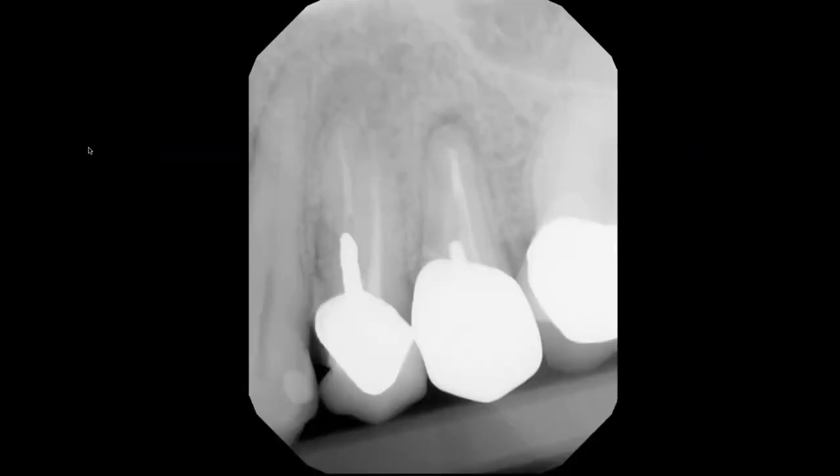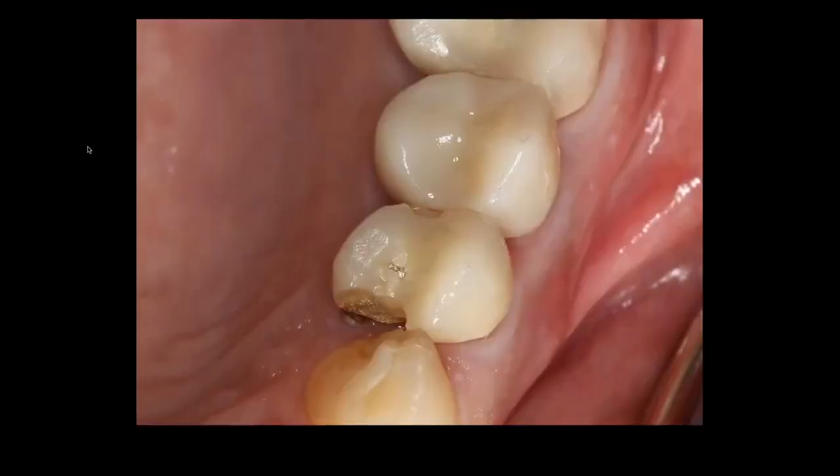Let's go through a technique where we lose a facial plate of bone and how we manage it. We have two bicuspids that are deemed non-restorable and we're going to remove these teeth.